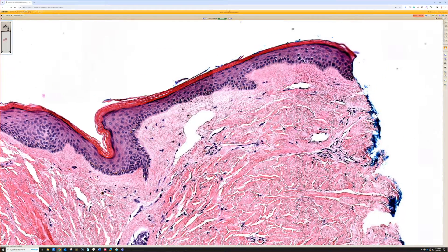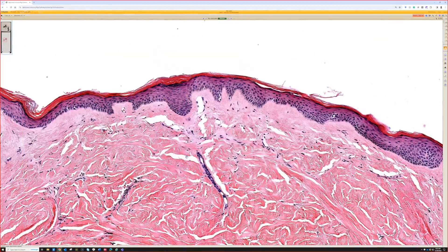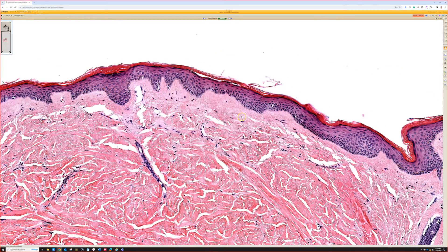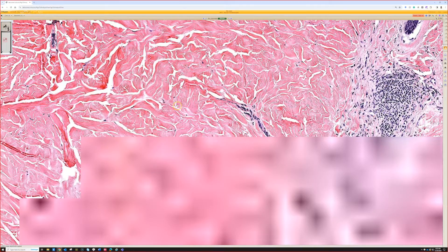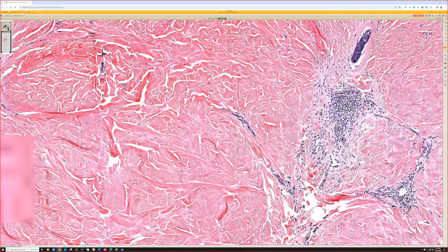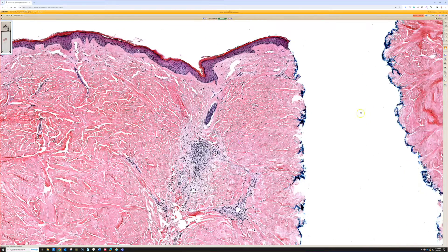There's another entity that can overlap with morphea: lichen sclerosis atrophicus, or LSA. Lichen sclerosis hyalinizes and makes sclerotic collagen in the papillary dermis, but tends to spare the deeper reticular dermis. There is such an entity as lichen sclerosis/morphea overlap, where you get lichen sclerosis changes up top and morphea changes down below. So those are things you need to know about in your differential.